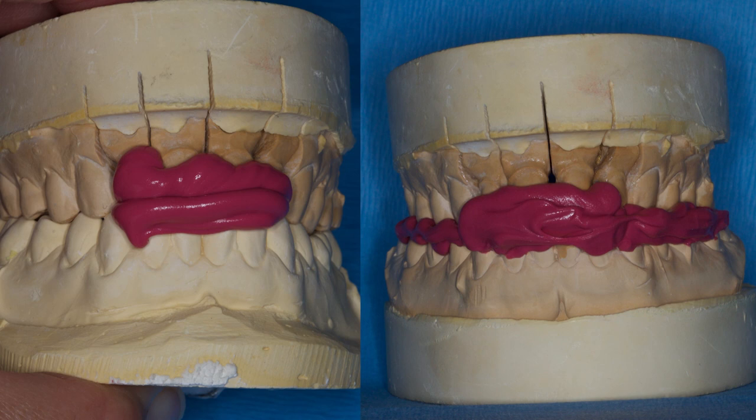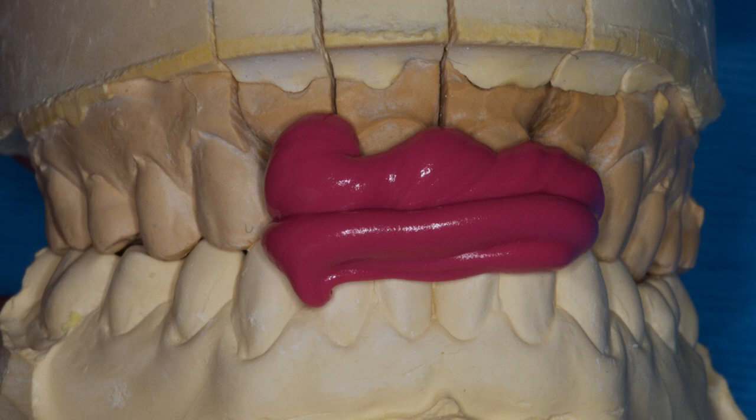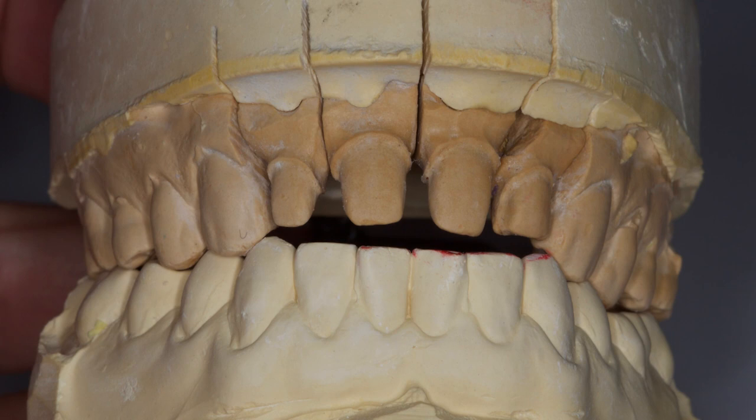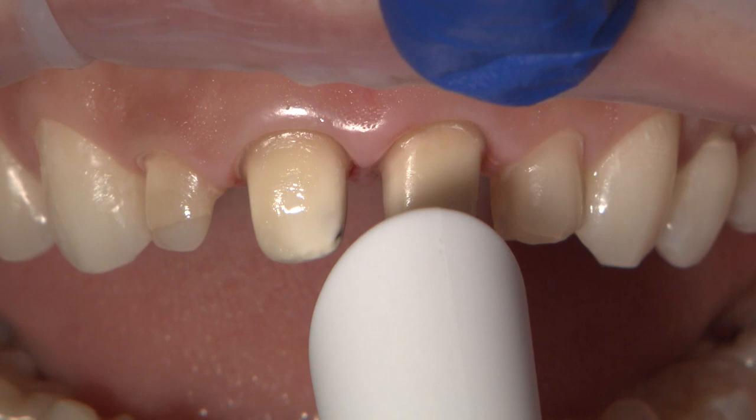If this record is taken with the mandible slightly in a forward position, when the lab articulates the models, it will show a decrease in occlusal clearance. As we can compare in these photos, the models are articulated with the silicone record material placed only on the prepared teeth versus a full arch record. Note how there are spaces between canines and less incisal clearance for the veneer on number 10, and when the bite is placed only on the prepared teeth, it will allow the patient to more easily locate the MIP, ensuring contact on the canines and more clearance incisally. During the delivery appointment and after the biotems were removed, the restorations were tried in, checked for margin accuracy, contact, and occlusion. Then the teeth and restorations were prepared for seating.